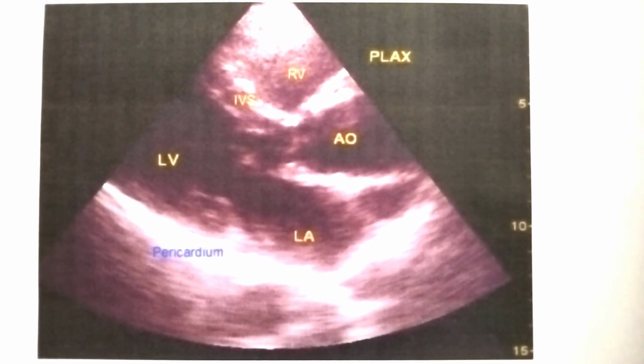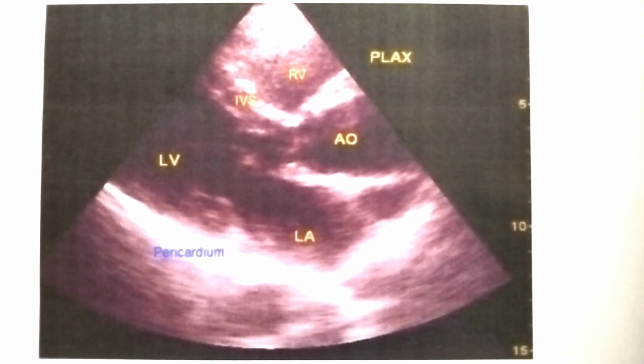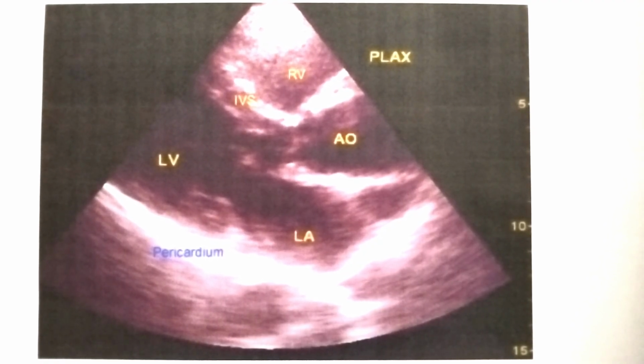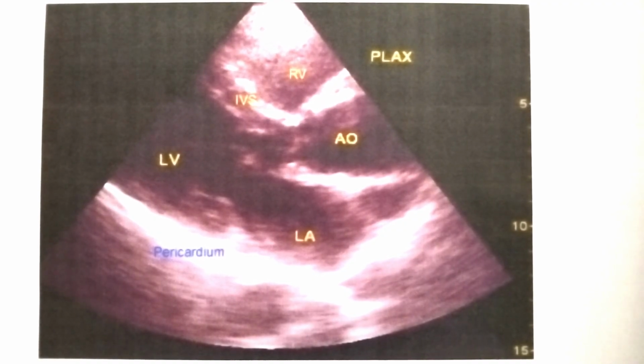Echocardiography is ultrasound imaging of the heart, usually done from four important transthoracic windows. Windows means usually the areas of the chest wall in which heart or major vascular structures do not have lung in between the surface and the structure. The four important windows are parasternal, apical, subcostal and suprasternal.